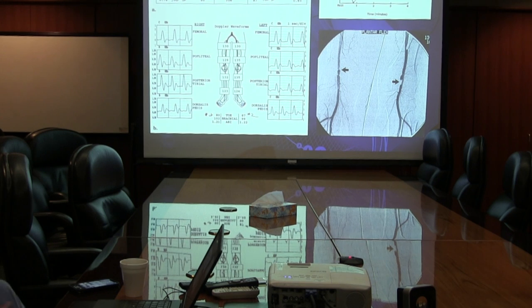It's really the same thing we do for a cardiac stress test, right? Just to diverge a little bit, when we do an exercise stress test with nuclear imaging, the nuclear isotope is absorbed by the myocardium, and then we can tune our cameras to that wavelength of energy and see where that's gone in the heart, where the perfusion is. So we do it at rest, and then we exercise the patient.